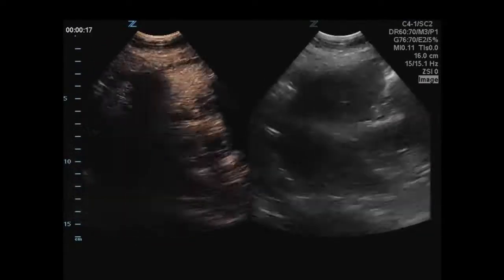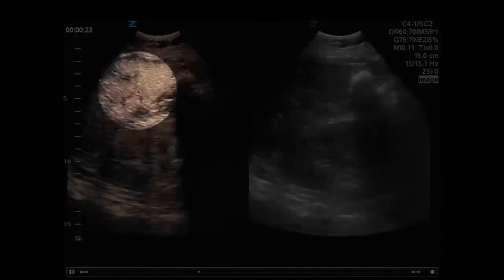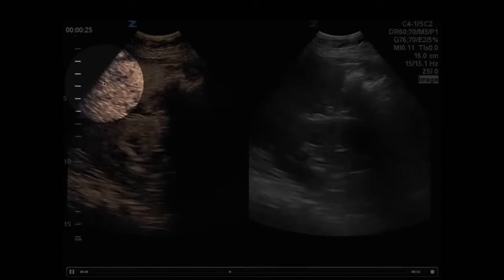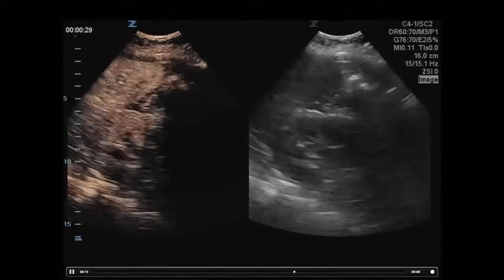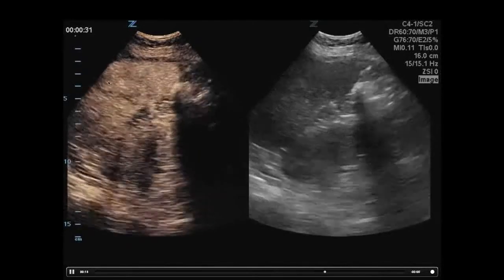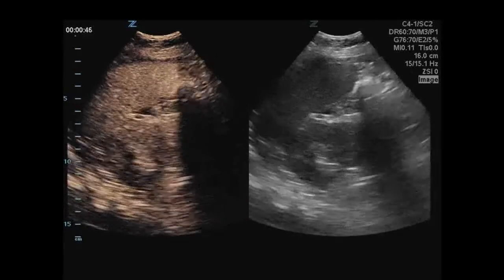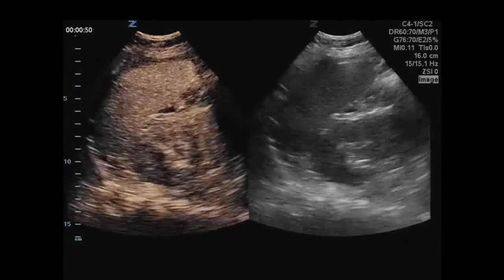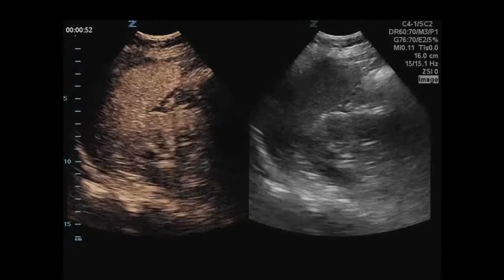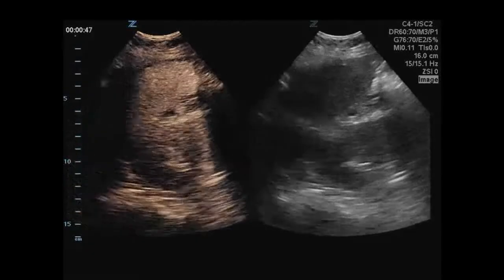If I have ultrasound and I'm looking and I have that flow void right about there, where you see that area where there's no filling and that little defect, the question is, is that actually a laceration or not? So I just watch it for a little bit and I go right back, and when I image it later, it fills in. So that's just the difference between the red and the white pulp. That's that zebra mixing just like you see on CT, except I don't have to re-CAT scan them. I don't have to re-inject them. I just wait a couple seconds and just keep imaging.